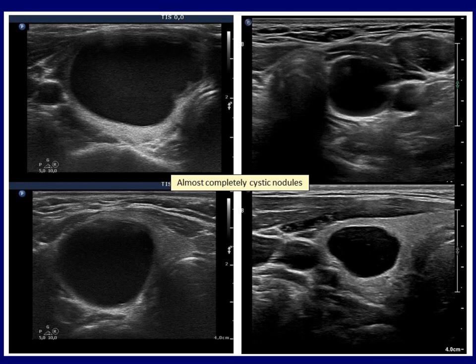One consideration: a fully anechoic pattern is very rarely seen. A non-anechoic portion is not equivalent with the solid part because it may represent either a fibrin clot or fluid with high protein content (left image), or a fibrotic bundle (right image).